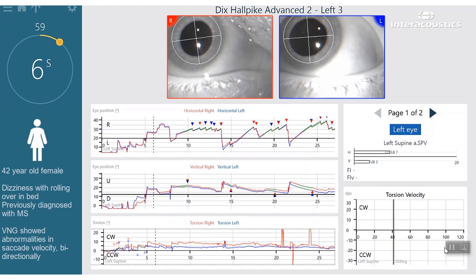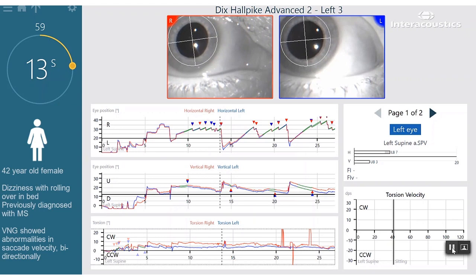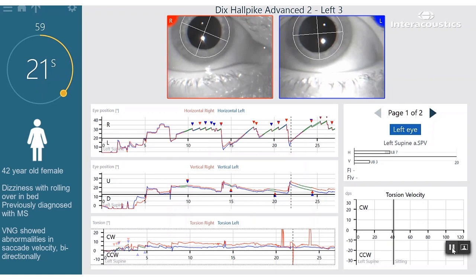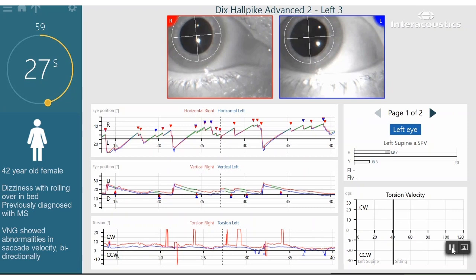Let's take a look at this case example. If you look at the horizontal and vertical eye traces and SPV graphs, you can see that this patient had 7 degrees per second left-beating nystagmus and 3 degrees per second up-beating nystagmus during the left Dix-Hallpike evaluation.